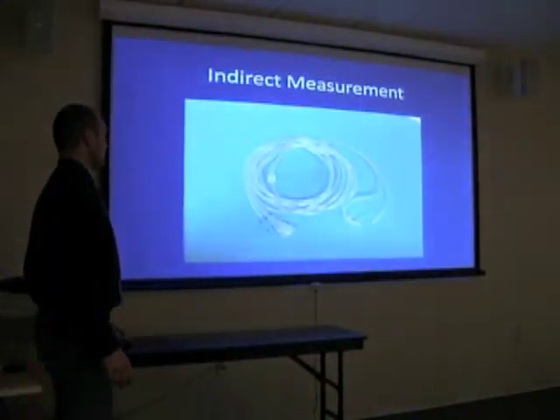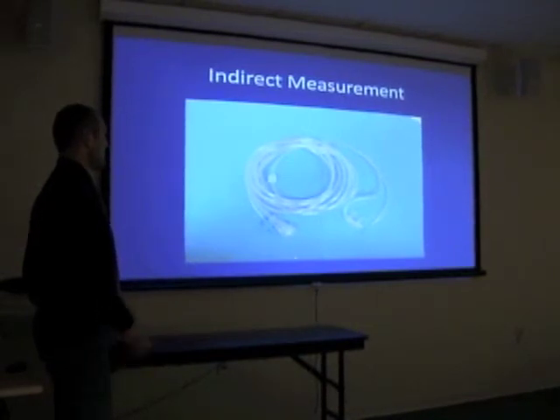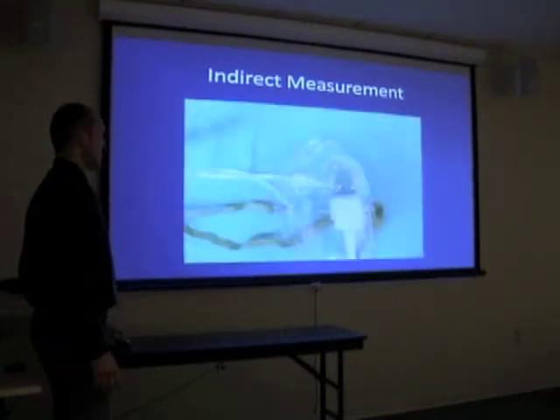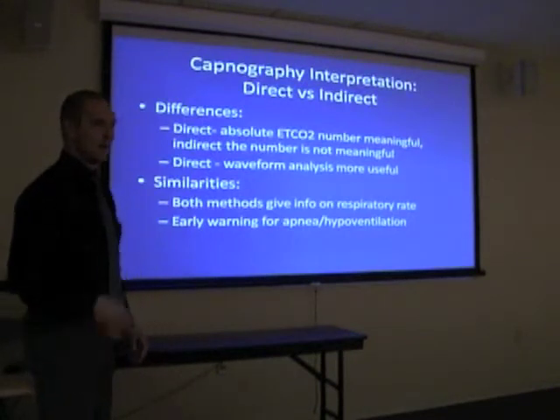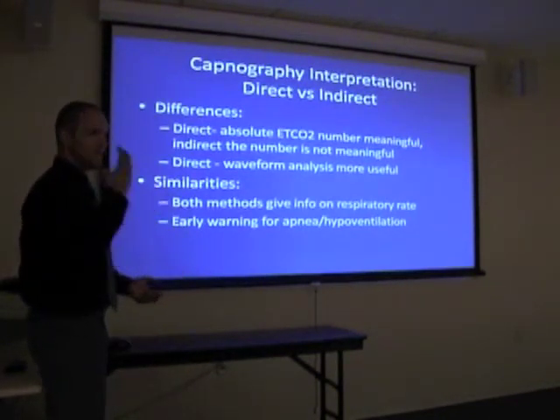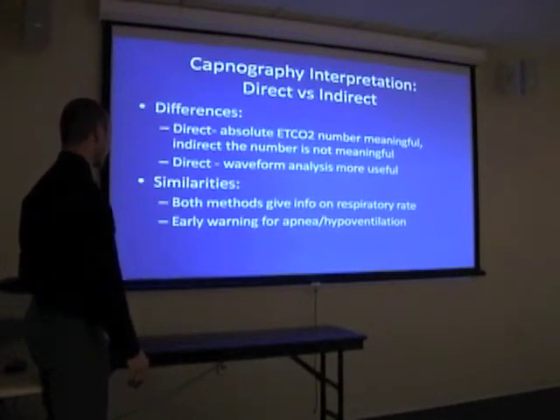This is typically the nasal cannula you're using, just has the 2 little holes at the bottom. Really gives you just a very basic sampling. This is what we use. We get a little better sample with it. You put a sampling port into the side and measure that. We actually have masks. Now we're going to try and get masks that have a built-in sampling port so that they don't have to do this rigmarole. But if you're not doing an EGD, you're doing a colonoscopy or something like that, I always like to use the mask because it's more comfortable for the patient typically too.